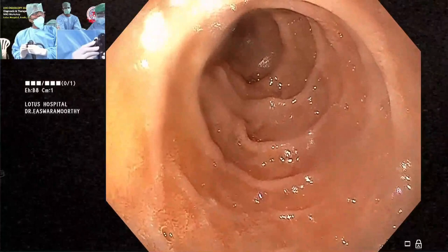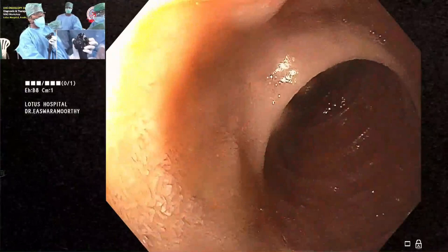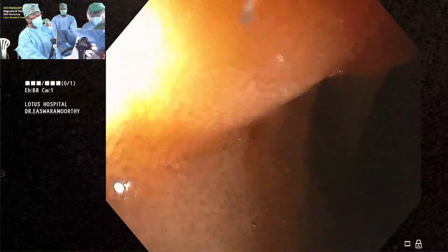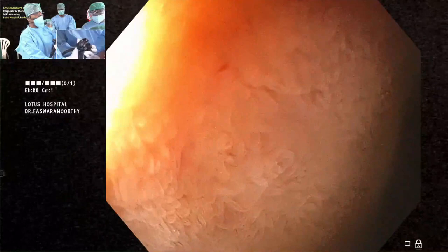After shortening the scope, hold it very close to the patient's mouth for better control. We are right at the ampulla — you can see it with a slight wait at the nine o'clock position. Slowly come back the shortest route; note how the villi are easily visualized. I will demonstrate underwater examination and biopsy technique, especially important in cases of chronic diarrhea. As we fall back, you can see the duodenum is deformed but not stenosed.